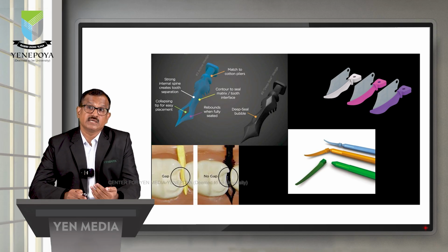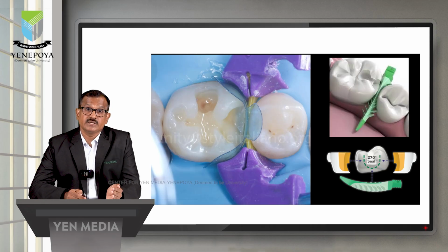They are wedge guards. They allow you to not only protect the adjacent tooth, but also, sometimes when we do deep margin elevation, it adapts so well clinically that we get a very good clinical result. That's the reason we go for such wedges.